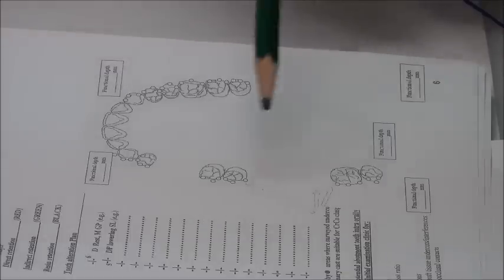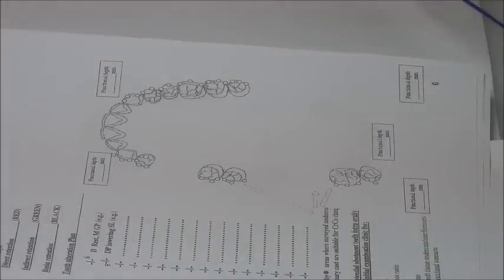here we are thinking about, okay, this is an extensive free-end situation, everything applies. These are premolars and molar, I still can't place some components on them. But I have to add something here, which is what we call provision for extraction. Meaning that I want to place a metal component so that if I extract these teeth, I can simply add teeth in their place, and this is usually the indication of plates. We don't place reciprocal arms, we place plates. Because simply I can stick an acrylic tooth in place there, and if these teeth are extracted, I can stick teeth to the RPD. Okay?